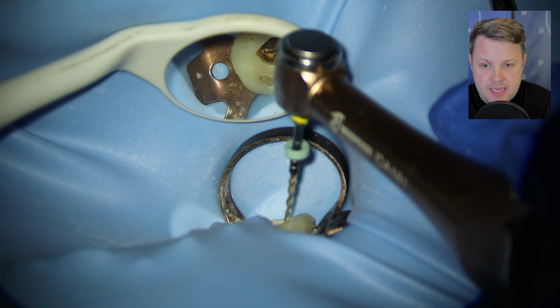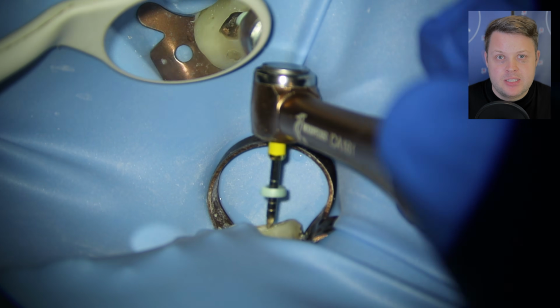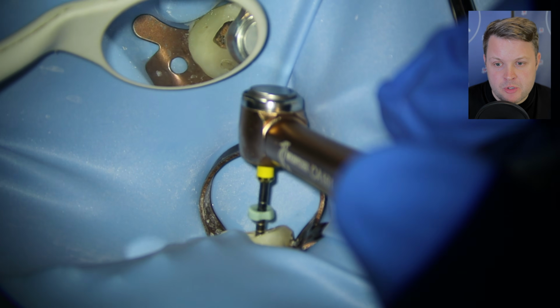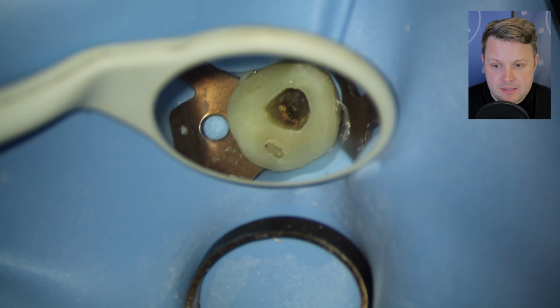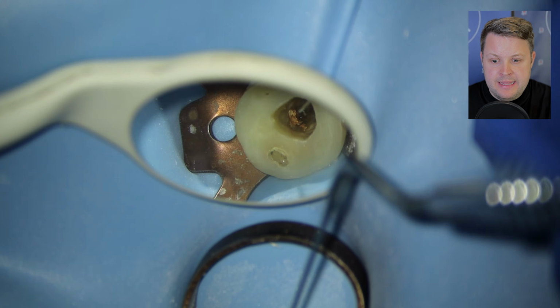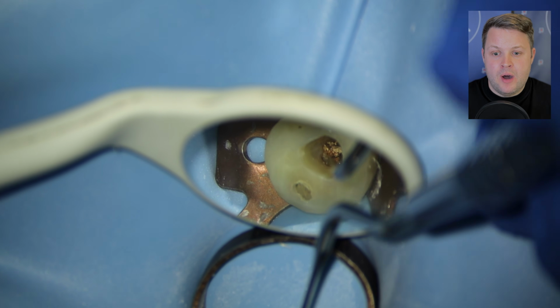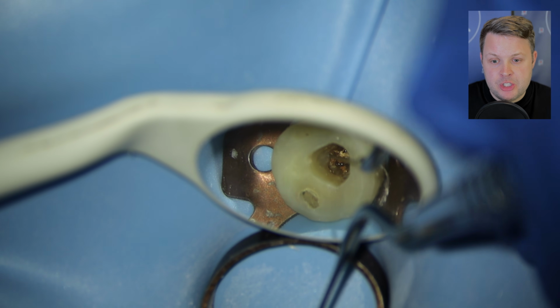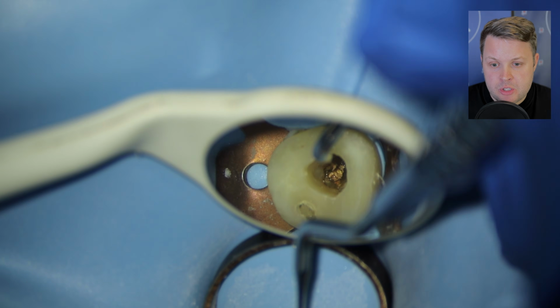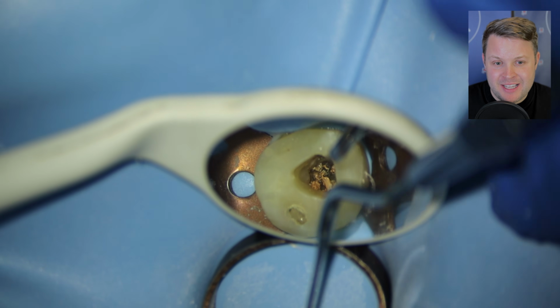In this case, I'm going to go straight for our rotary files. A lot of the time, I like to get the DG endodontic probe to pick the GP, and then use a succession of Hedstrom files. But I know in this case the obturation is very poor and it's not at the working length, so I'm not massively concerned about extruding GP out the end of this tooth. So I'm happy to just try and whiz a rotary file down there.